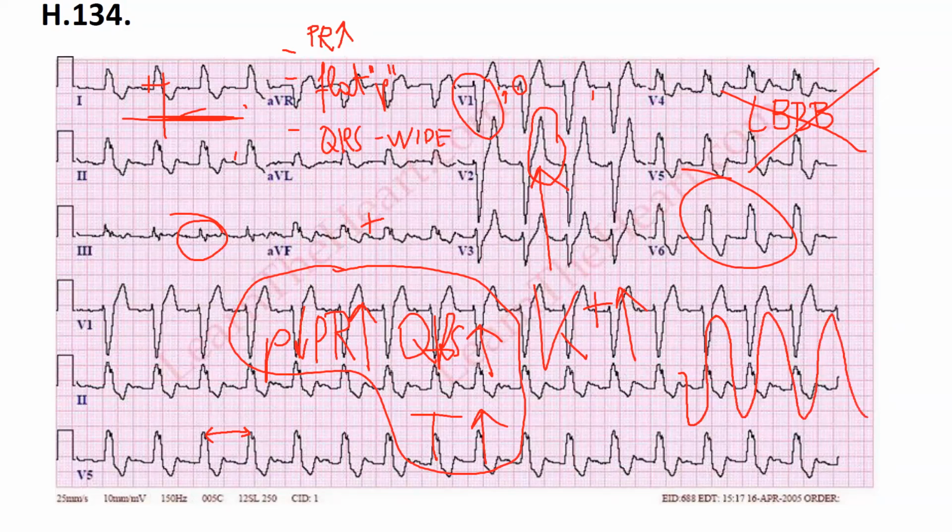If you have a very severe hyperkalemia, you can see something like this, almost a flutter, for example a ventricular flutter, and you have no idea which one is a QRS and which is a T wave. In somebody with very severe hyperkalemia, the ECG device often shows double the actual rate, because it considers the big T wave a QRS complex as well.